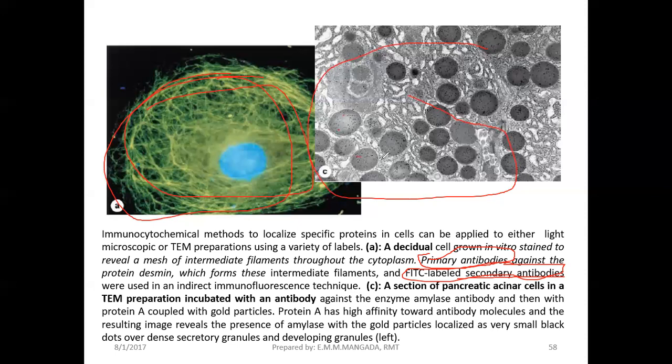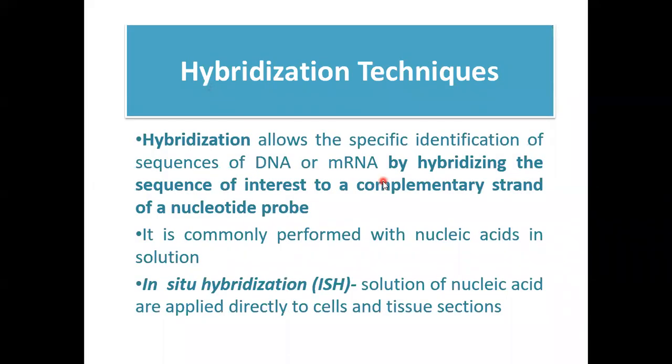Okay? So that's the application of your immunohistochemistry in your tissues, or we call it immunocytochemistry when we're referring to its application in cells. Same principle, okay? So next, we have here the hybridization technique. We have here, okay guys, the hybridization techniques.